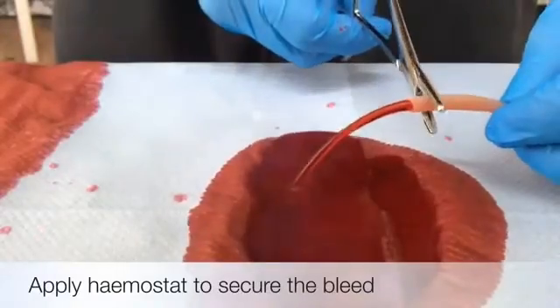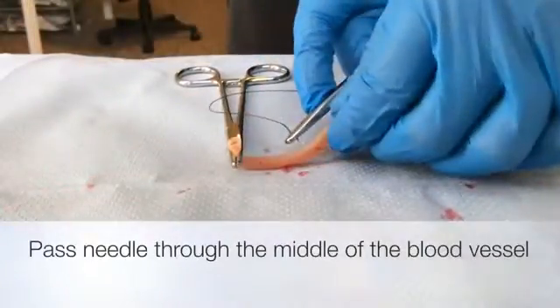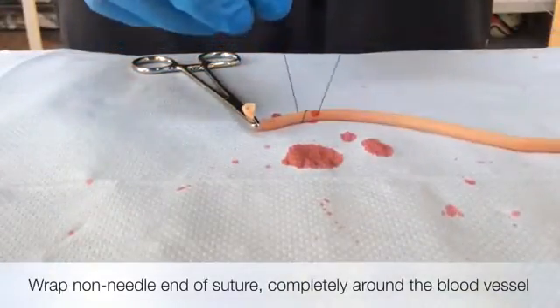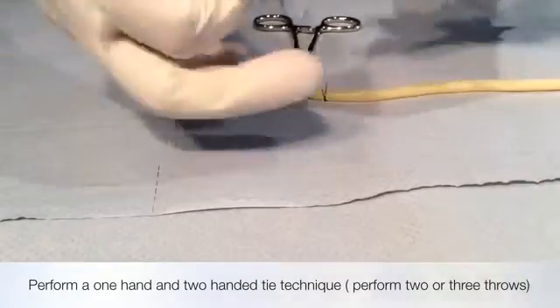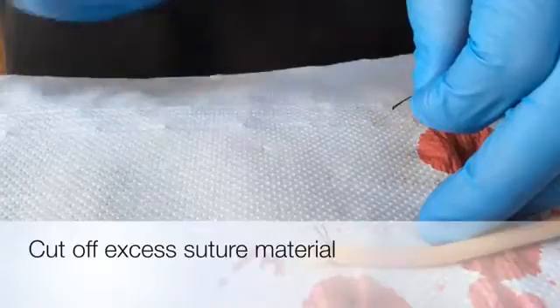To summarize: apply a haemostat to control the bleed, pass a needle through the middle of the blood vessel, then perform a one or two-handed tie technique, and cut off excess suture material.